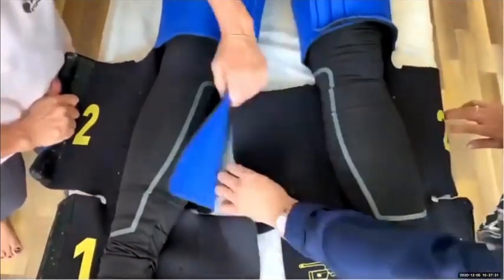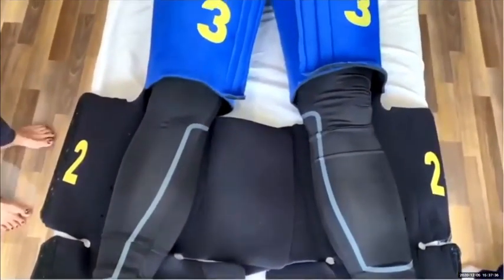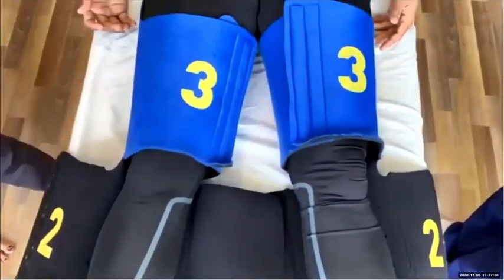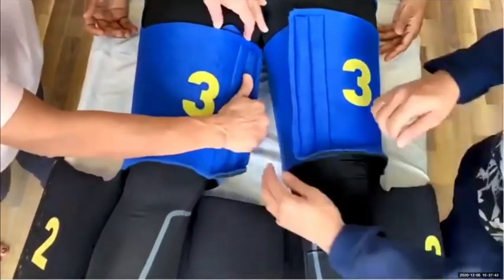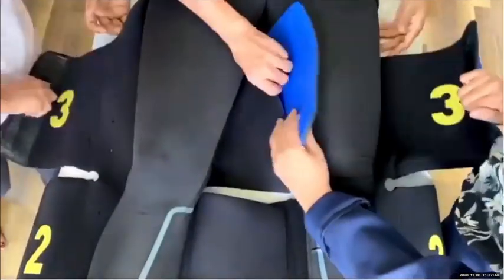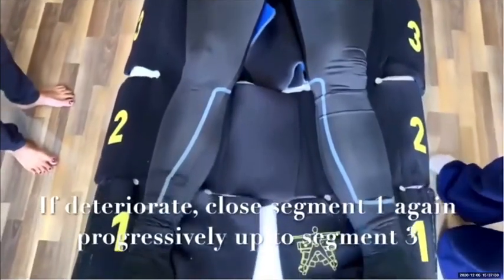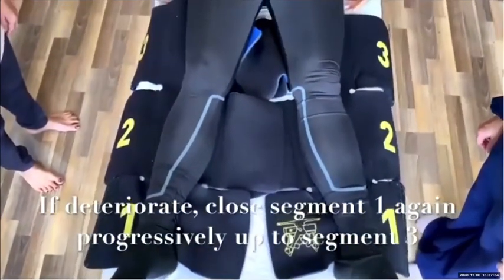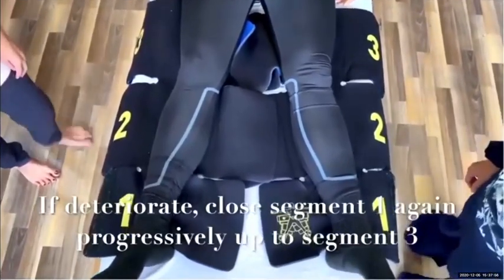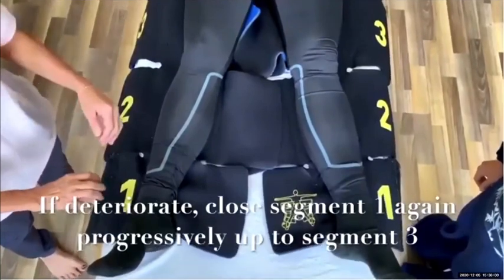Progressively remove segment three after 15 minutes, ensuring her pulse rate and blood pressure remain stable. However, should she deteriorate, close segment one again and progressively reapply up to segment three.